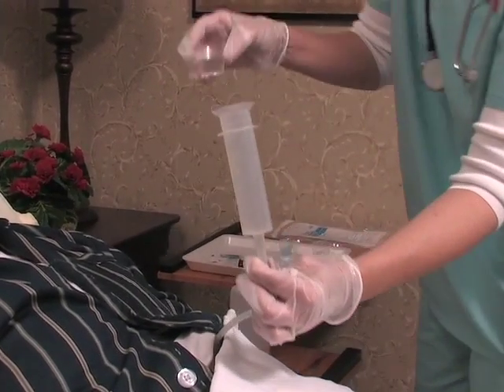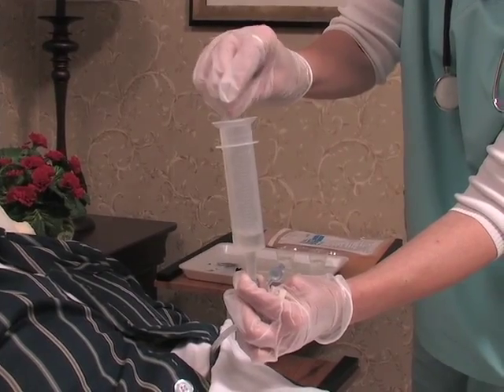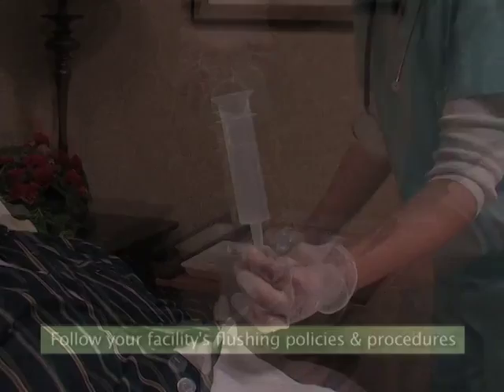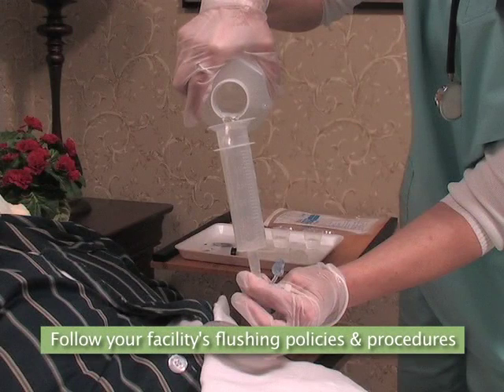Our nurse is demonstrating a 5 to 10 cc warm water flush between each medication to keep the G-tube patent and reduce the risk of potential medication interactions. As an alternative to flushing between each medication, some facilities' policies and procedures require flushing only before and after the group of medications due at the time. This is an acceptable practice as long as there are no known incompatibilities between medications administered concurrently. If incompatibilities exist, flushing between medications is required. So be sure to follow your facility's policies and procedures for flushing.